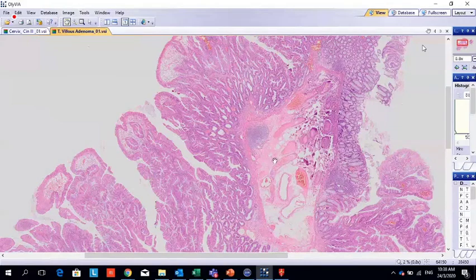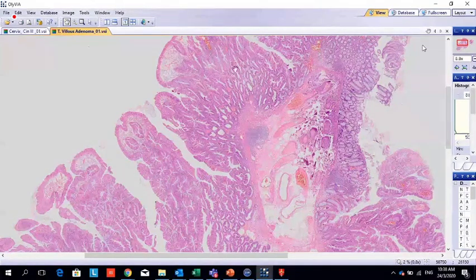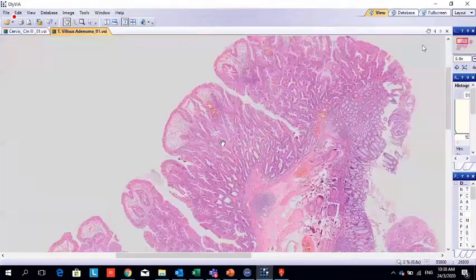If there is invasion into this stalk, that means it is invading the submucosa. In this case, we call it adenocarcinoma rather than adenoma. But if the changes are only in the polyp epithelium, it is still considered adenoma.